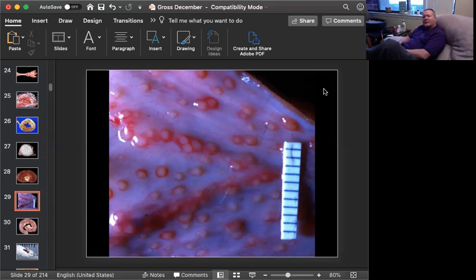There are several types of cystitis in the dog. Most commonly, they're proliferative. Sometimes they're emphysematous. In this particular case, this is known as lymphoid or lymphofollicular cystitis, and all these are little lymphoid follicles. The cause is chronic bacterial infection.